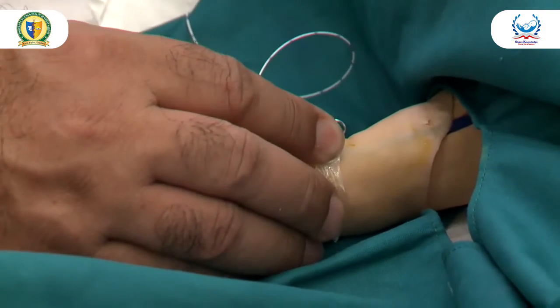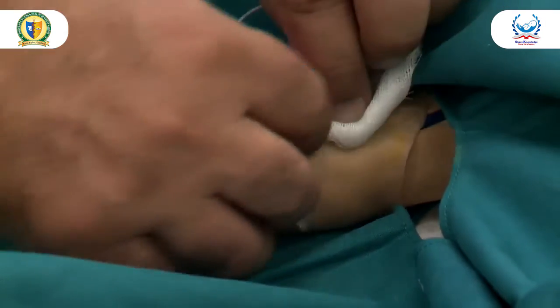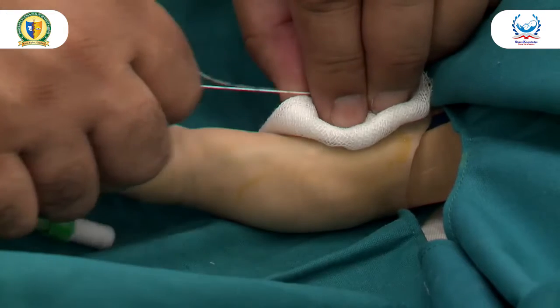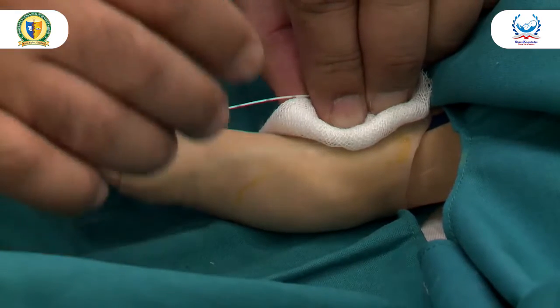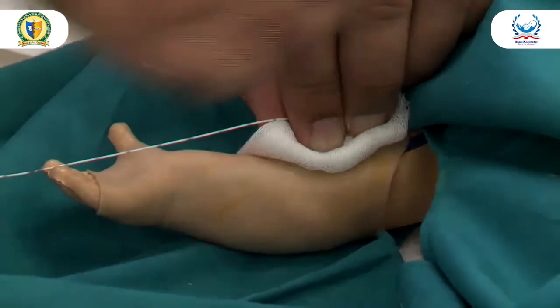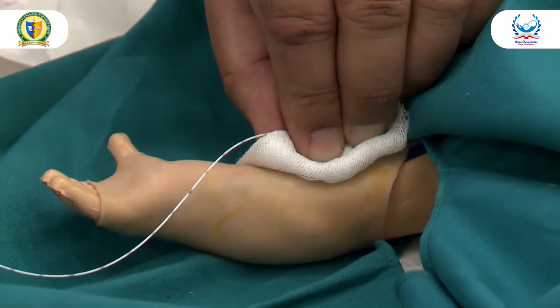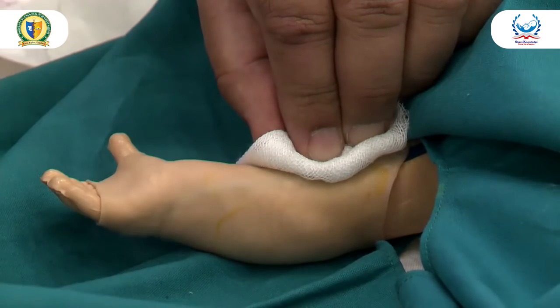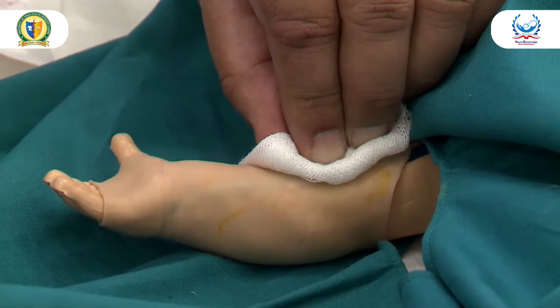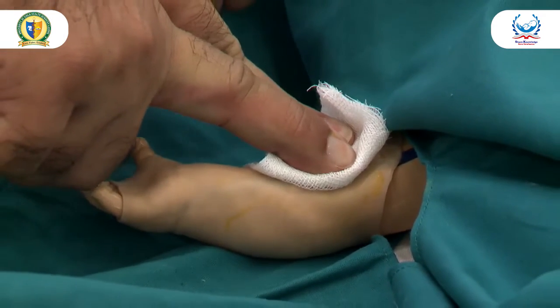Now comes the entry point. Put a gauze piece here and take it out, gently just drag it out, gently. If it gets stuck, push a little bit of fluid, warm the other extremity, and then gradually pull it out with this non-toothed forceps till it comes out. Previously, you would send the tip for culture, but it is not done anymore. After that, keep your hand here for 2-3 minutes.